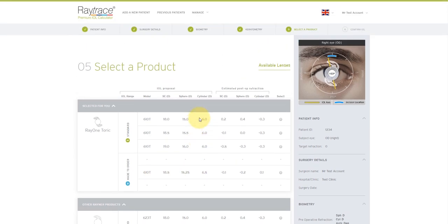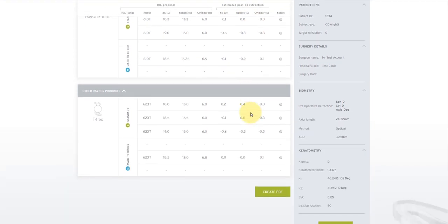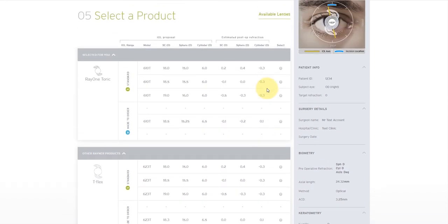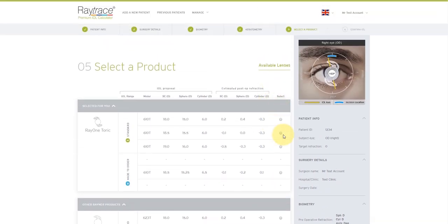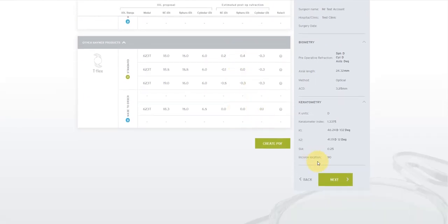At any point during the calculation, you can click across the grey bar across the top to change and check your figures. A green tick here indicates a completed section. You can create a PDF across the bottom, which will generate a PDF of these options available to you. Once you've found a suitable lens that you wish to order, select it once with the radio button and then click Next.